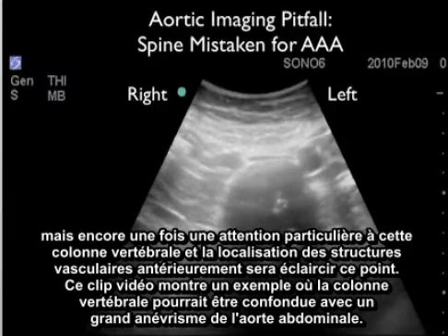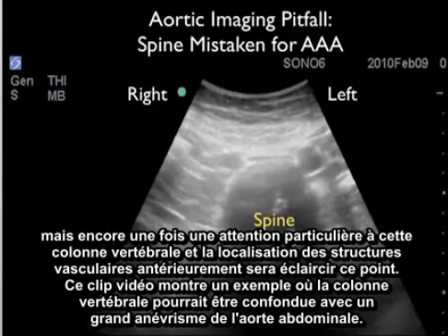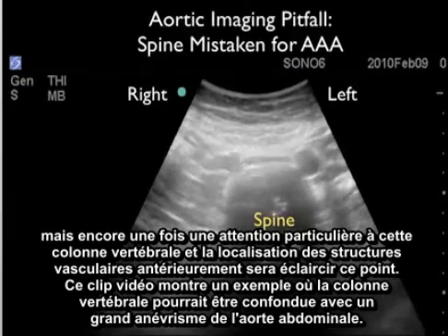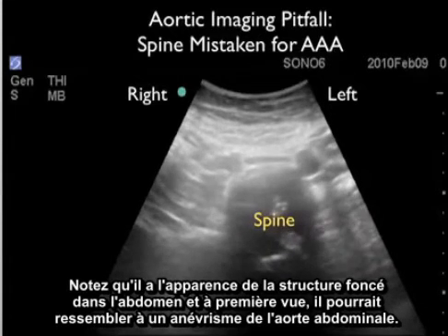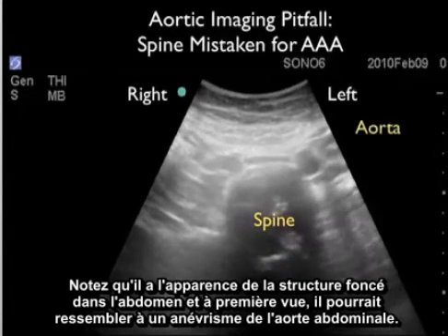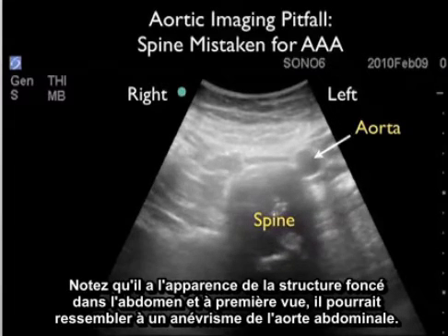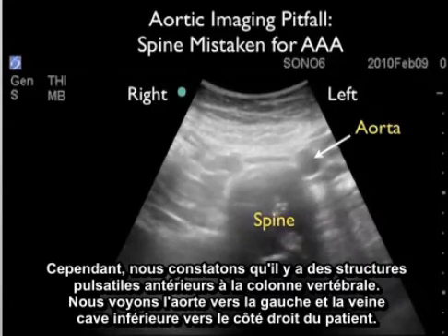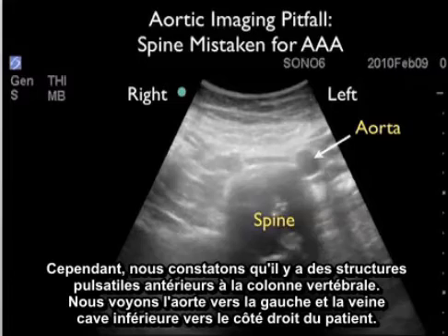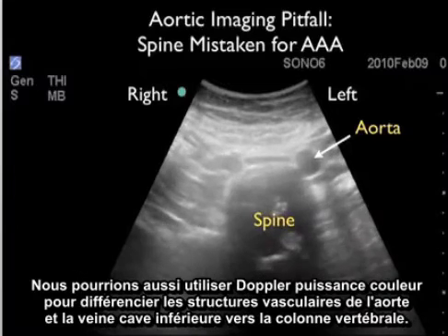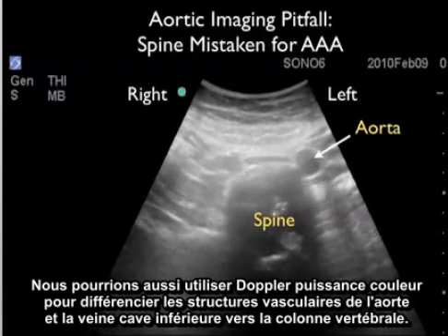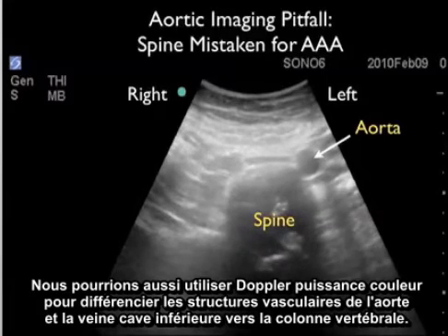This video clip shows an example where the spine could be mistaken as a large abdominal aortic aneurysm. Notice that it has the appearance of a dark structure within the abdomen, and at first glance it could look like an AAA. However, we note that there are pulsatile structures anterior to the spine — we see the aorta to the left and the IVC towards the patient's right side. We could also use color power Doppler to differentiate the vascular structures of the aorta and IVC versus the spine.